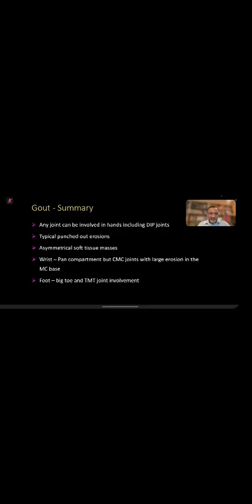You may wonder why these cases are sometimes shown. It's because we are a tertiary center. We get these cases from the periphery and we look at them when everything has been done. So generally, we hardly do any. If we know it's gout, we'd never do MR at all.